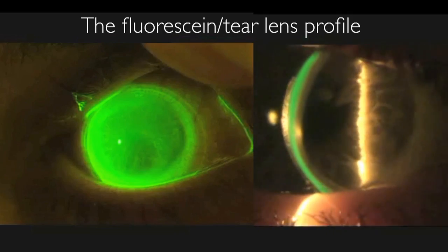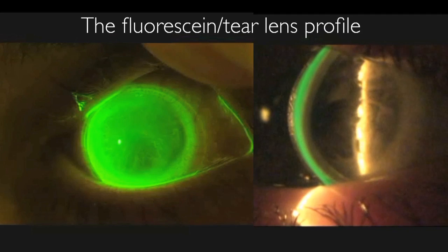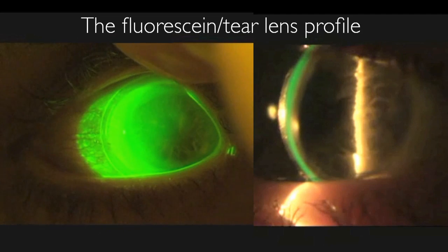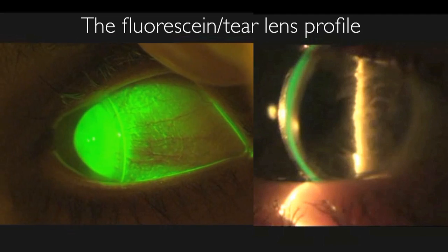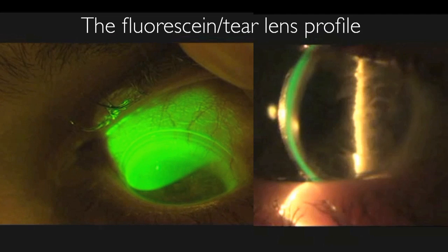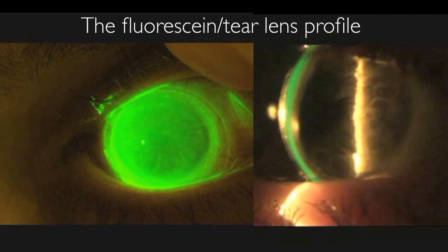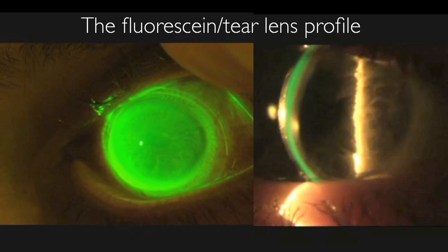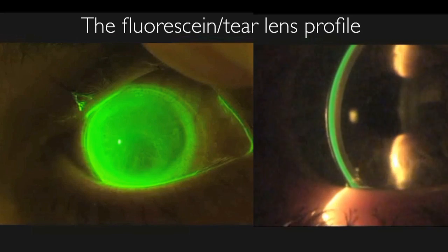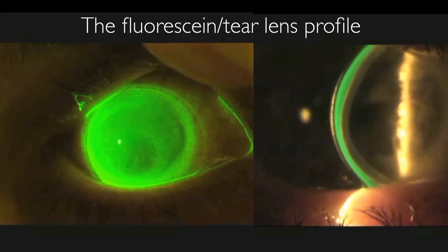I look at the eye, I look at the cornea and the sclera, looking at the corneal depth and the scleral shape. So let's look at evaluating the fluorescein pattern. On the left, we have our traditional fluorescein pattern, where I'm using cobalt blue filter light from the slit lamp and the yellow enhancing filter in front of the objective of the slit lamp to enhance my evaluation of the fluorescein behind this lens. On the right, I'm using white light, a thin optic section.